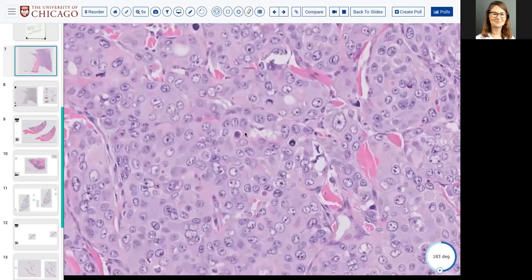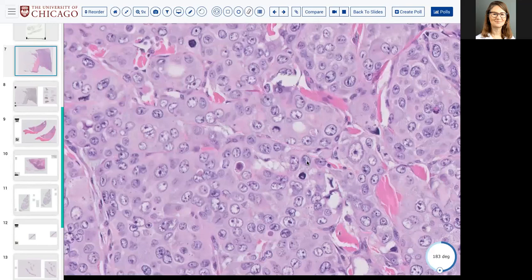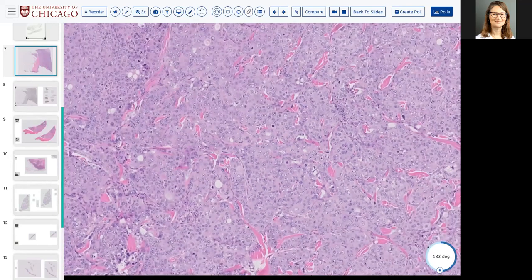However, don't forget that appearance could also be rhabdomyosarcoma, right? Or something with rhabdoid differentiation. So you'd certainly want to at least attempt a desmin, and if the desmin is positive, a myogenin, just to exclude or confirm any kind of rhabdo or rhabdomyoblastic differentiation. Yep. So I think of the chromatin remodeling complex, and I think of the muscular. But yes, this was INI1 lost.